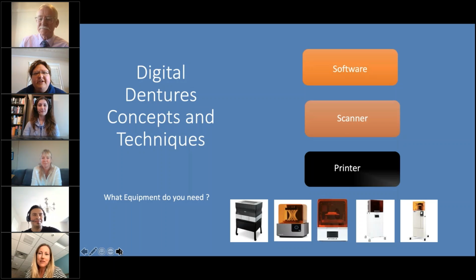Very, very similar to Tanya's. Actually, the Asiga is our 4th 3D printer. We started with an entry-level open printer, a lot of failures. Then I went to a Formlabs just so I could really understand how 3D printing worked. I played around a little bit with the filament style type printer. Time frames just were not there. And then we ended up buying the Asiga.